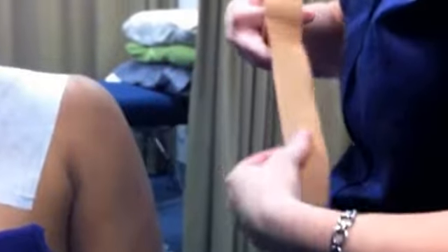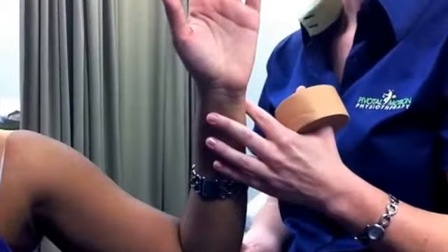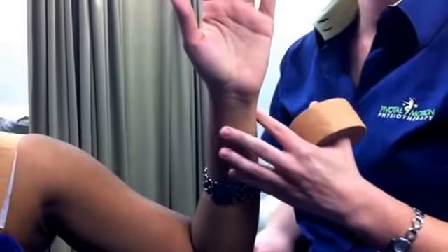Begin by positioning the shoulder such that it is in slight elevation and shifted posteriorly. Maintain this position while applying two strips of rigid tape to fan over the AC joint. The tape is applied anterior to posterior.